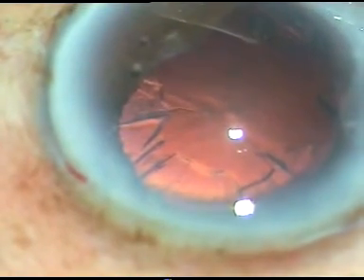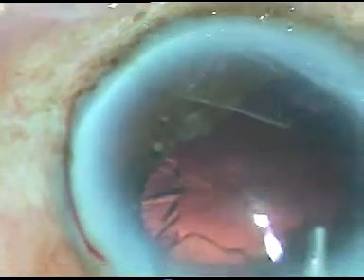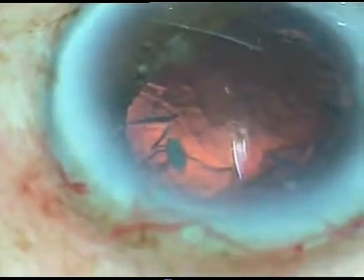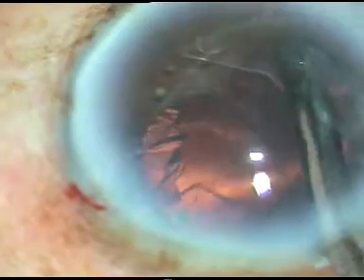Now all the nuclear fragments have been emulsified. Viscoelastic substance is being injected. We can see there is a very small nuclear fragment just in front of the side port on the left side. My aim is to remove this small nuclear fragment before I aspirate the cortical matter. I have removed that small nuclear fragment.